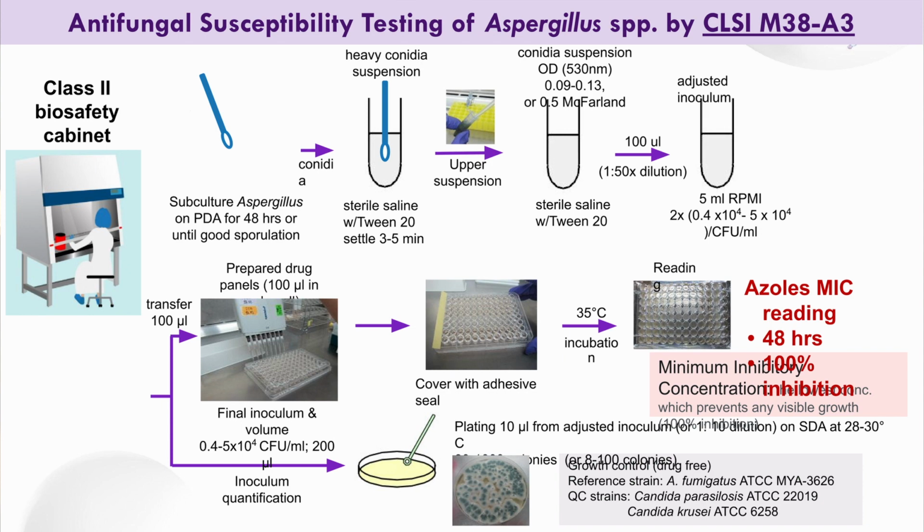Because Aspergillus will produce large numbers of airborne conidia, the procedure should be performed in a Class 2 biosafety cabinet.